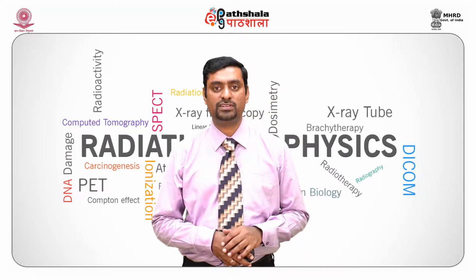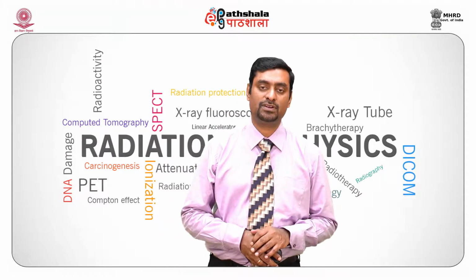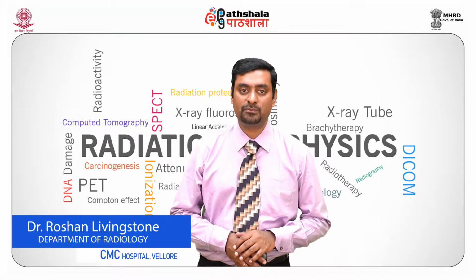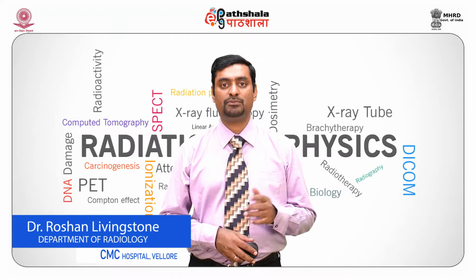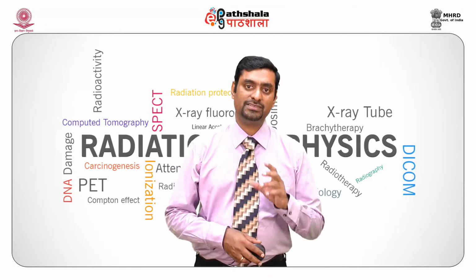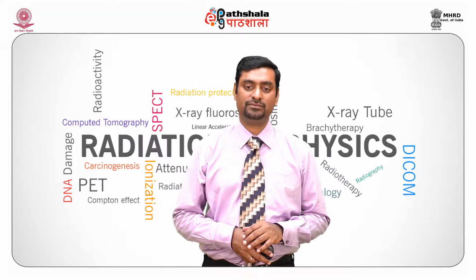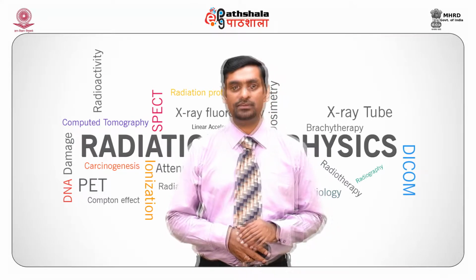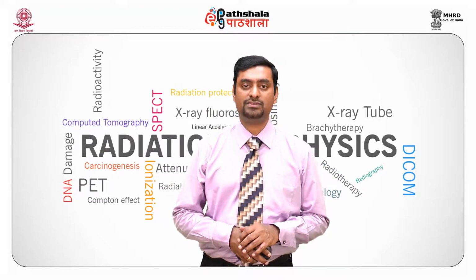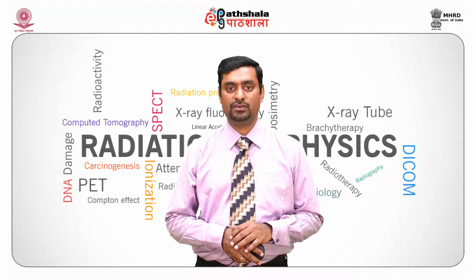The X-ray tube potential for imaging the soft tissue ranges from 20 to 35 kilovolts depending on the thickness of the breast. Molybdenum target is used for smaller breast thickness. For breast thickness above 6 centimeters, rhodium target can be selected. Then we have the filter. The use of the filter is to enhance contrast sensitivity.